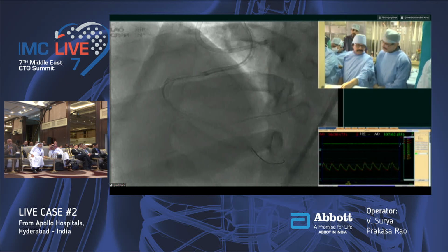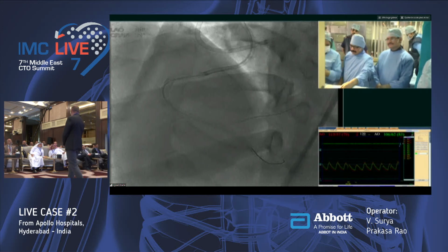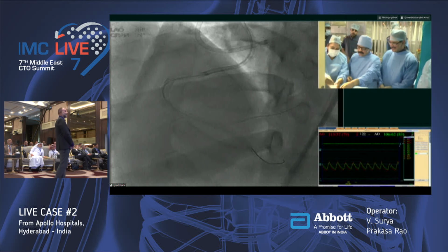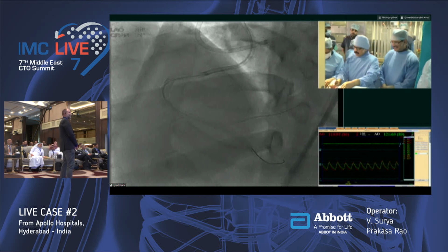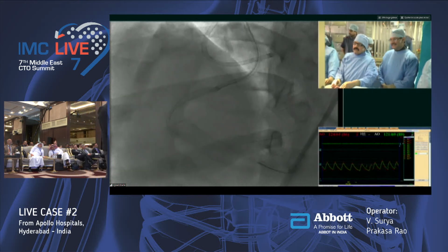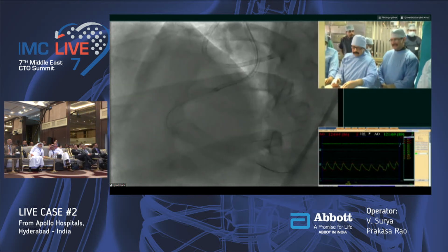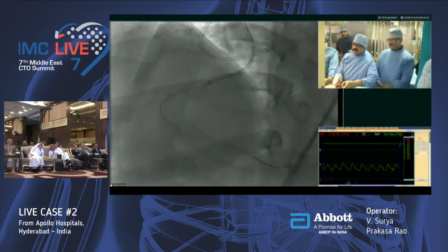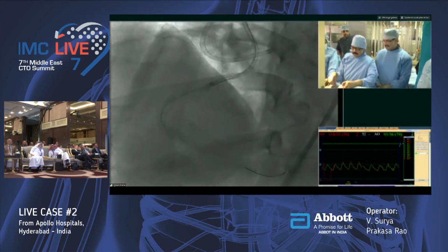So everybody is confident about the crossing of the 1.5 Tazuna balloon? So far we are optimistic for this tough case, so hopefully fine. But for difficult, tough lesions, Tazuna usually crosses this type of side branch ostium, we have seen. So now we are confident.